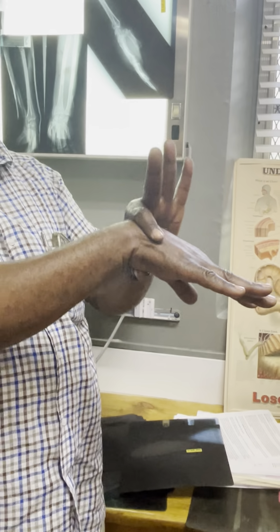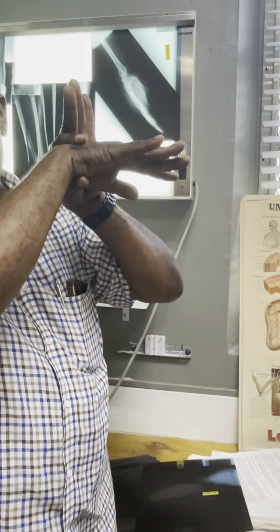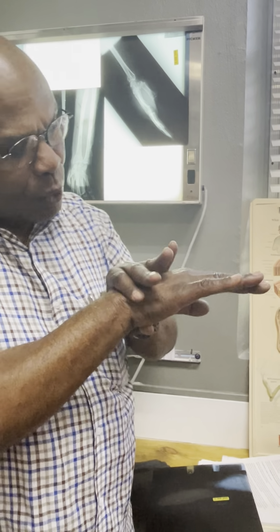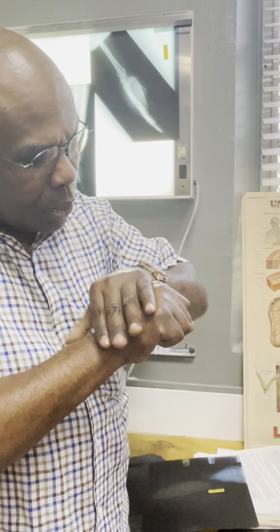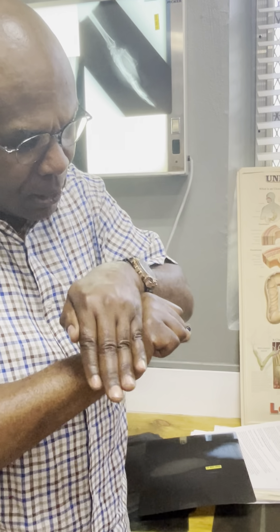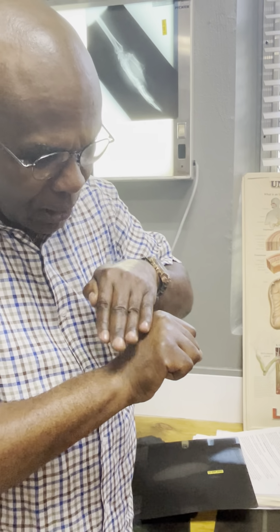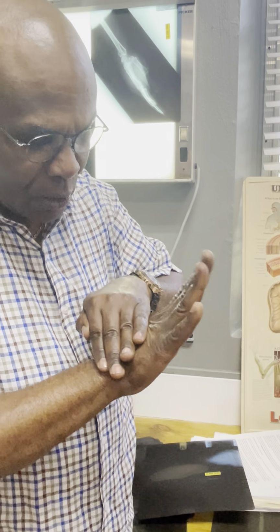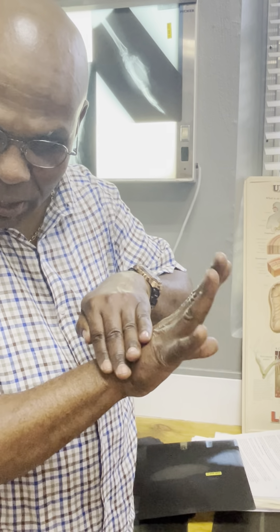So see how the U stops it? Yeah? So the medial bit is the bit that's exposed. Agree? Also, you remember I said, you don't include the finger. No, you don't include the knuckles. You leave those MCP joints free so the patient can start the third R immediately.